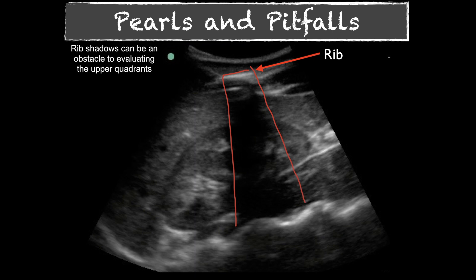A lot of people will get this image and call it a negative study, but technically this would be equivocal — you can't make a correct interpretation. You can see the hepatorenal space for most of the image and say there's no fluid there, but in the shadowed region you can't make a call, and there could be subtle fluid hiding there. You need to work around rib shadows and visualize the entire hepatorenal space. Having the patient take a deep breath can push the kidney down and help you visualize that area.